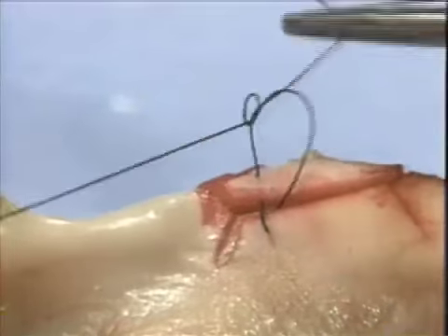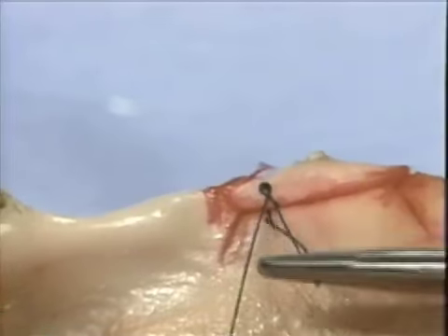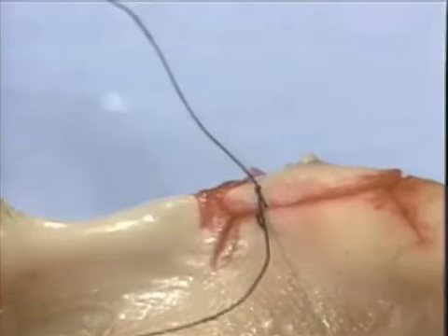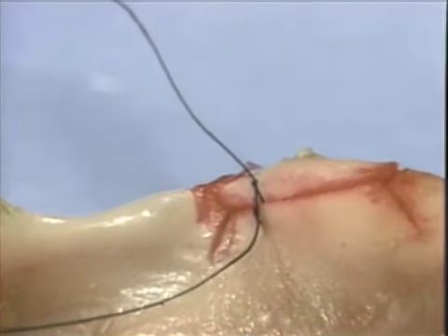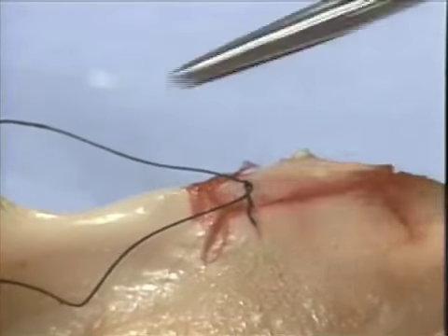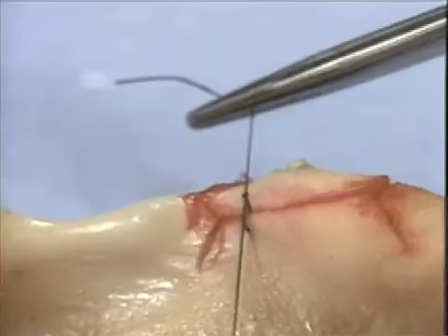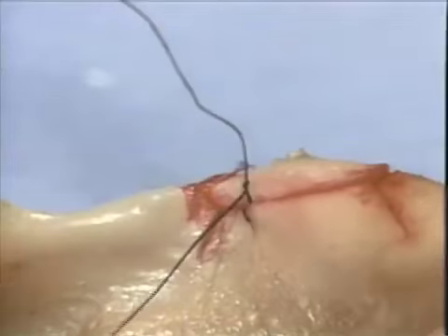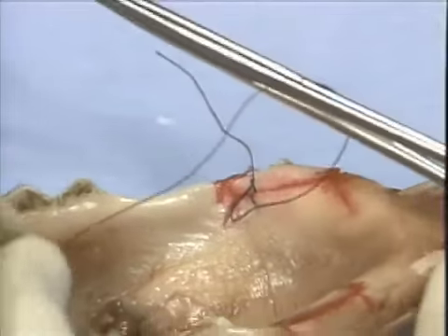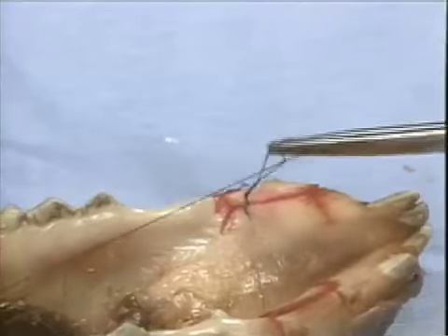The suture is tied tightly to approximate the buccal with the lingual flap. The knot is ideally placed either buccal or lingual to the incision. While this suture accomplishes apposition of the buccal with the lingual flap, it leaves suture material resting between the two flaps in the incision line.